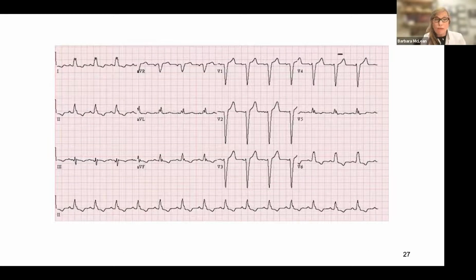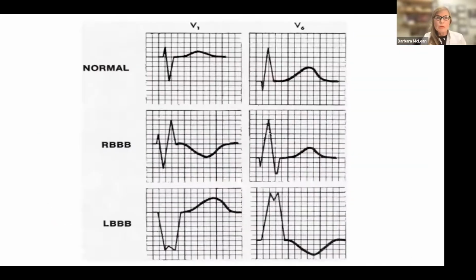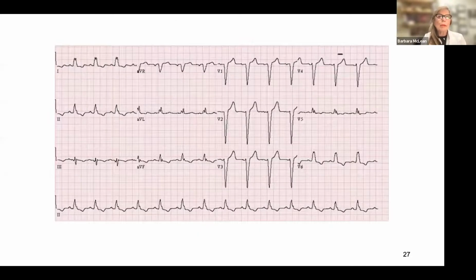You can see first for axis, you are upright, upright in lead 1 and upright in AVF. So normal axis. Okay.